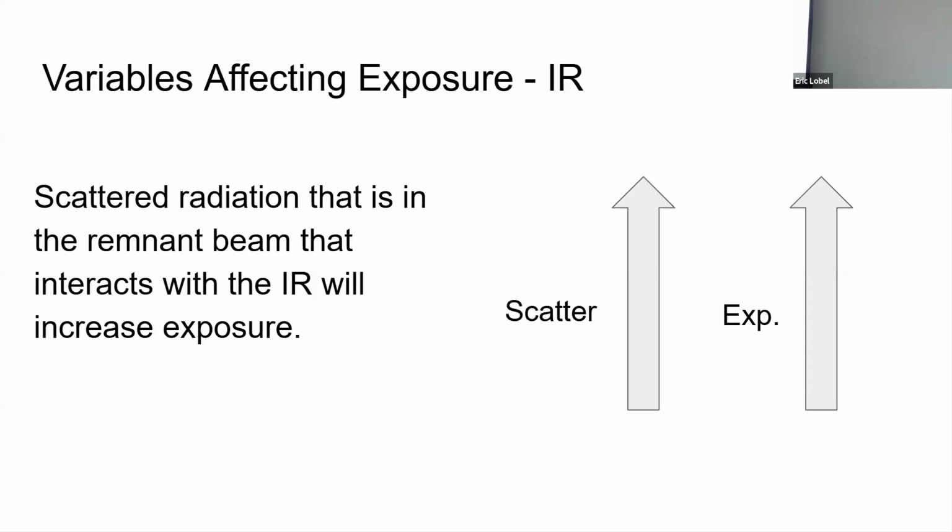Because the techniques that we set are based, whether we remember it or not, on the fact that there are grids built into the tables, right? When you hit that preset for lumbar spine, it knows there's a grid there, and it's not using some kind of noise reduction technique. Maybe using a little bit of something in there, but not a full-blown one to the point where you get rid of the grid completely. So we're getting there, right?